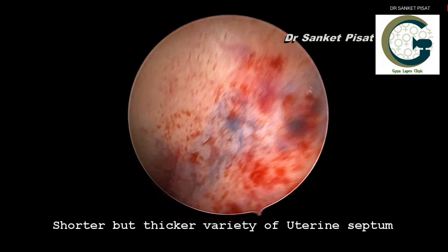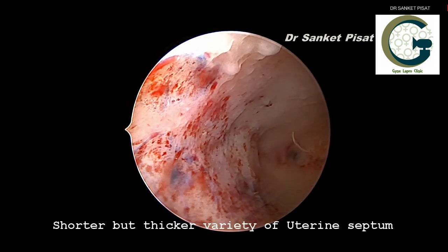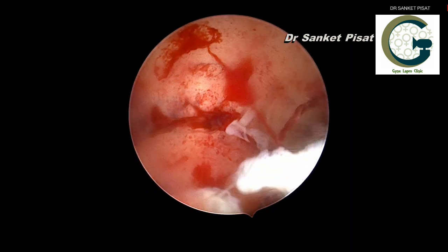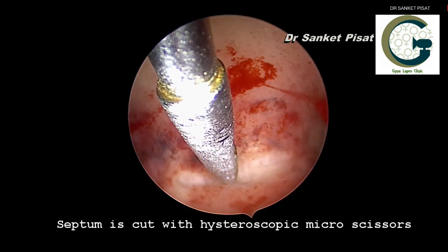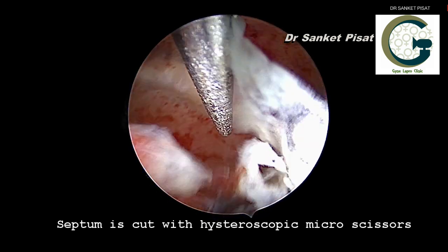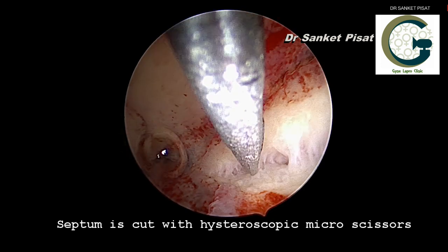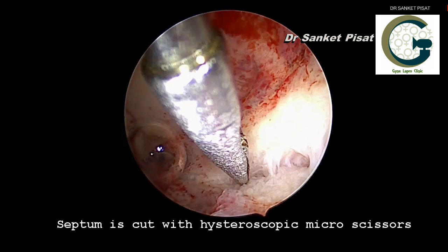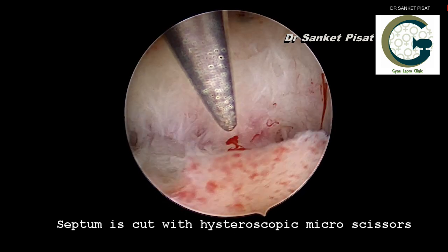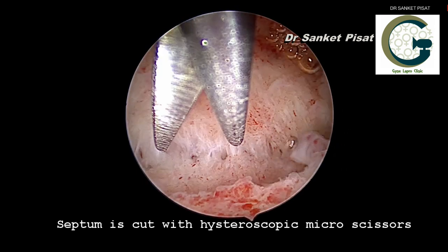There is another variant of the septum which is a shorter but thicker variety, and here we can see the uterine tubal ostium on one side and a thick muscular bridge which is separating the two. The treatment for this is cutting the septum with the hysteroscopic micro scissors in an effort to reshape the uterine cavity back to its normal shape. Gentle cuts are made in the intervening bridge which is separating the two ostia and an attempt is made to refashion the cavity back to its normal shape.